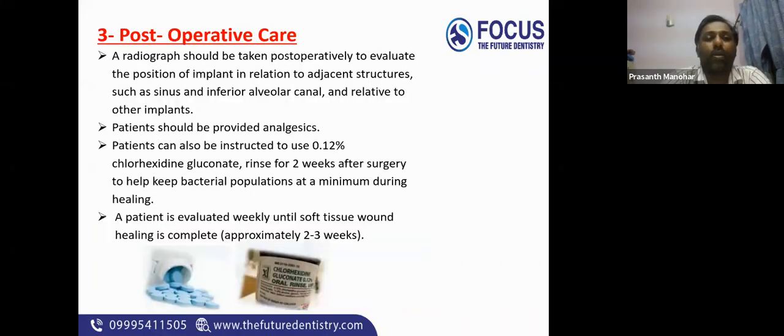Now, what about the post-operative care? A post-operative radiograph is taken to know the position of the implant in relation to adjacent structures such as the sinus, inferior alveolar canal, or any other implants or the adjacent teeth. The patient should be provided analgesics. The patient should use a chlorhexidine rinse for the next 2 weeks after the surgery so that there is minimal bacterial growth around the implant or the healing site.